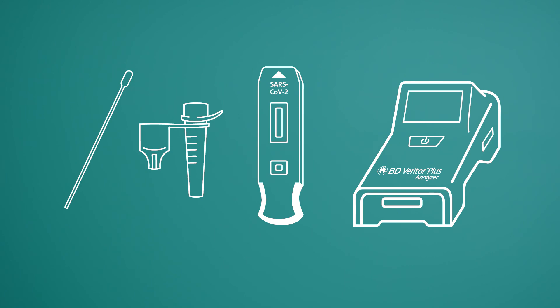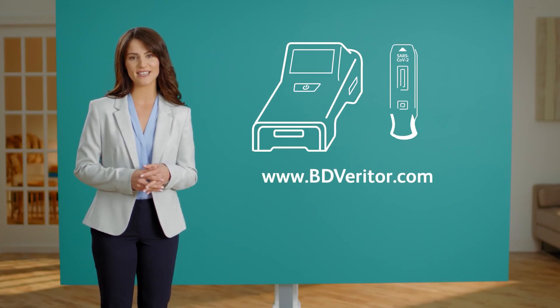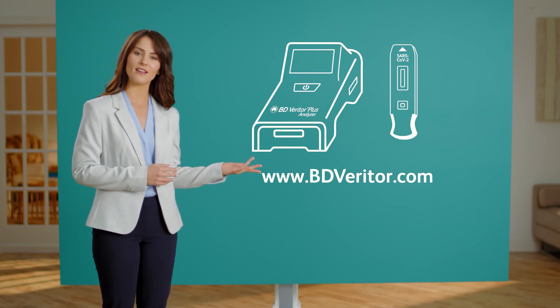When combined with your BD Veritor Plus analyzer, the BD Veritor system for rapid detection of SARS-CoV-2 test kit makes COVID-19 testing easy, rapid, and reliable. For more information on performing COVID-19 testing on your BD Veritor Plus system, visit BDVeritor.com.